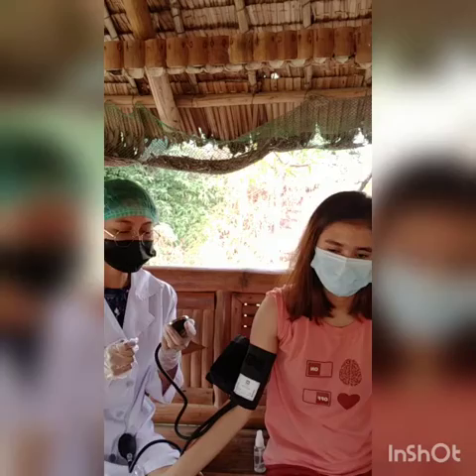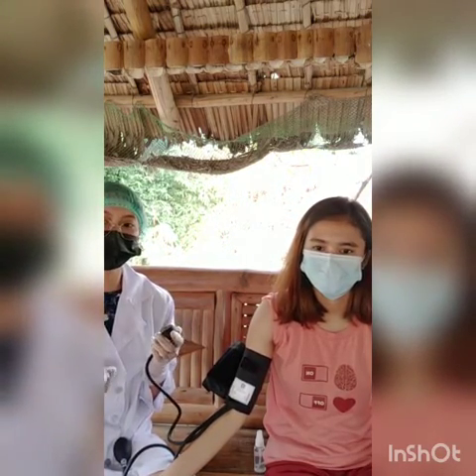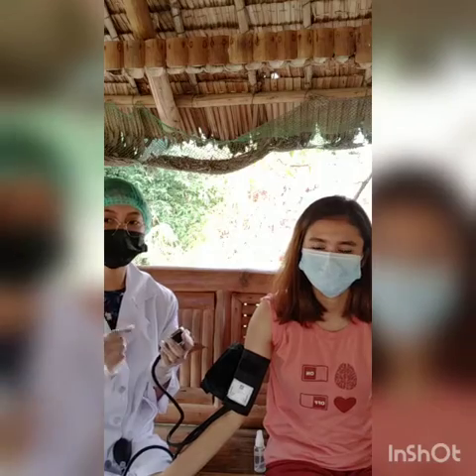Mercury. And then after that, if using manometer, check to see the manometer is the vertical position and the mercury is within the 0 level with the gauge at eye level. So, nasa 0 siya.